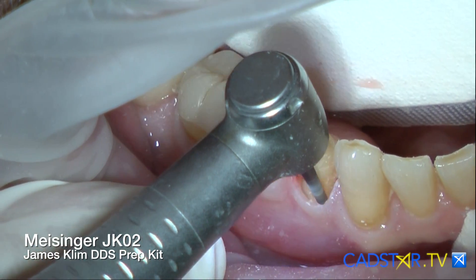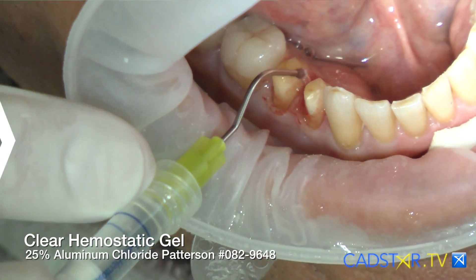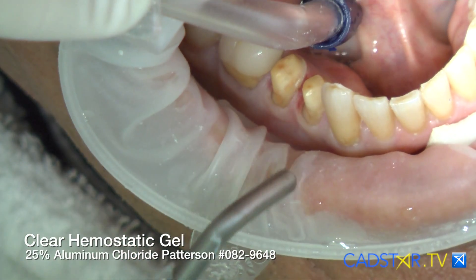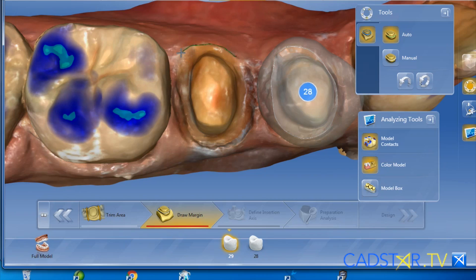What I'm going to do is prep away the tissues I don't want to be in place, then come in with hemostatic gel. Hemostatic gel is 25% aluminum chloride — it will stop the bleeding and turn the tissue slightly magenta. With the magenta color on your soft tissue sub-gingivally and a nice clean margin, you'll have no problem finding the edge of that prep. And that gives you a lot of security.